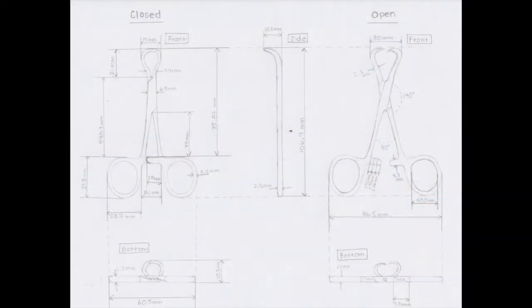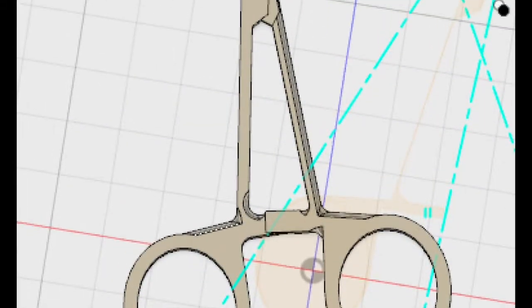Measurements of this instrument were taken using calipers, and drawings and renders were produced in Autodesk Fusion.